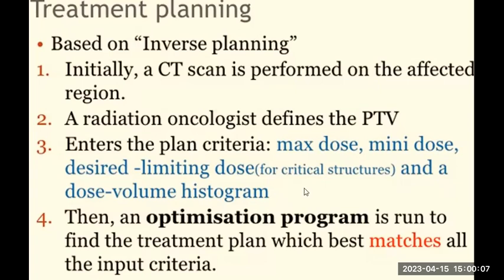Okay, next an optimization program is run to find the treatment plan which best matches all the requirements. The optimization program consists of the dose level and the PTV.